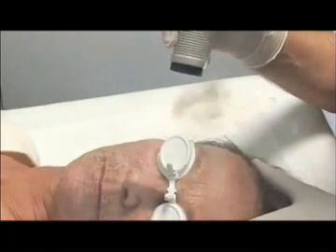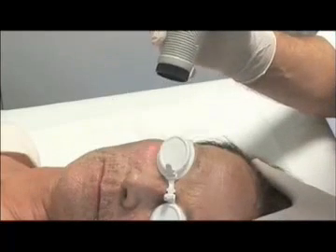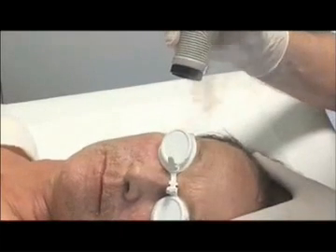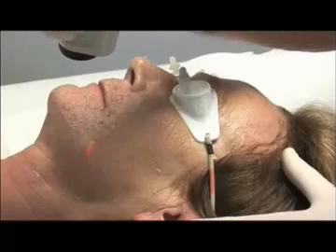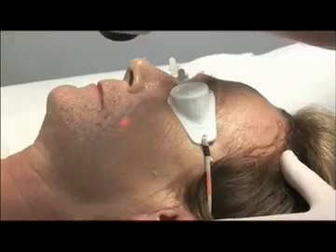Perpendiculaire à la cible cutanée. When we are perpendicular to the cutaneous target, we are at a full power. If we incline the beam slightly, like this, for more fragile areas, we decrease the intensity of the impact, perpendicular to the target.